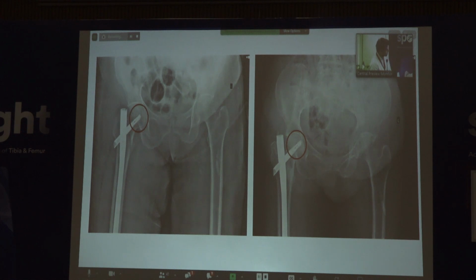So I think the TFNA is very strong against rotation, although if the proximal head element grab is weak, it collapses a little bit, because you do have the distraction on your fracture line after the reduction. So until the proximal fragment hits the nail, it collapses. It collapsed less than 10 millimeters, but I think that was the cause.